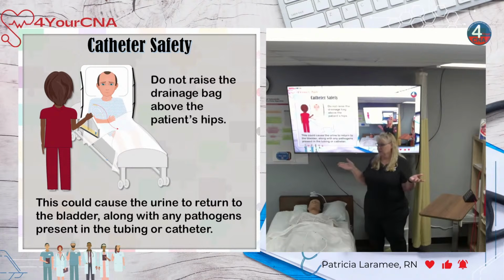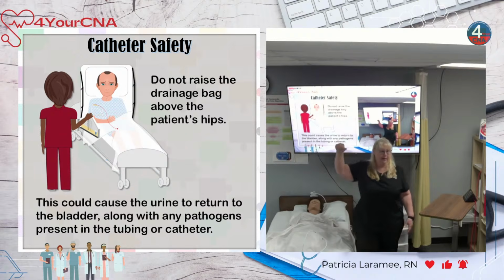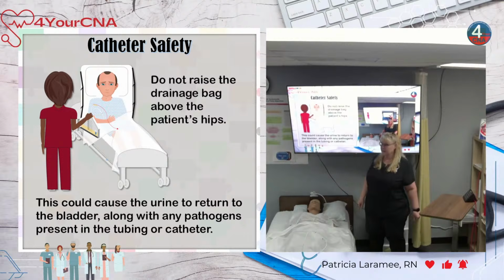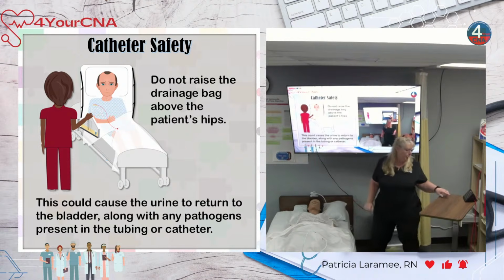Now, I watch a lot of health shows, and I can't tell you how many times I've yelled at the TV. My husband hates it because they'll show a patient care tech or somebody walking a patient down a hallway holding the bag up like this, holding the urine bag up as they're walking. And yes, no, we don't. No, don't do that. That's recycled urine. Even if it's yours, do you want recycled urine? No, don't do that. So bags always lower than the patient's hips, please. Okay. Gross. All right.